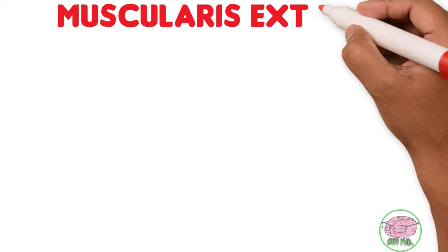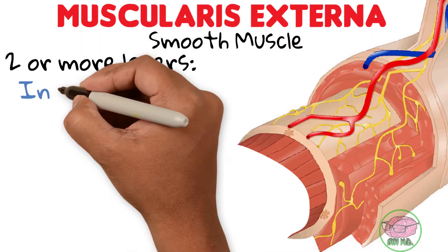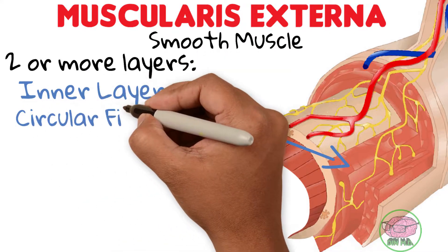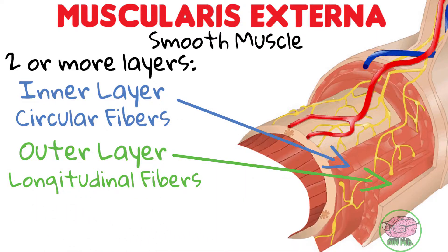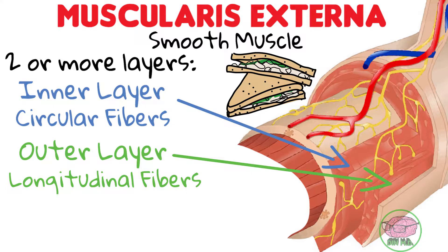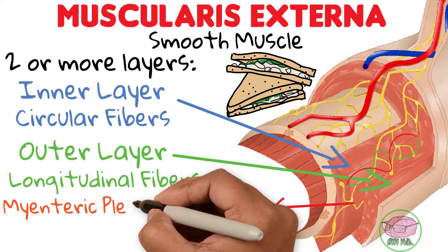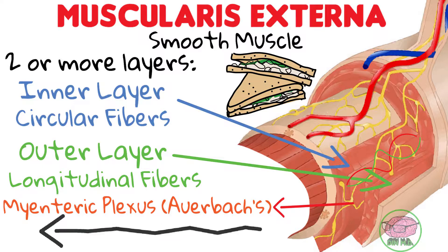The muscularis externa is made up of smooth muscle organized in two or more layers. The internal layer, closest to the lumen, has circular fibers, while the external layer has longitudinal fibers. Between these two layers, like a sandwich, we find connective tissue holding blood vessels, lymphatic vessels, as well as the myenteric plexus, also known as Auerbach's plexus, which controls the peristalsis of the gastrointestinal tract.